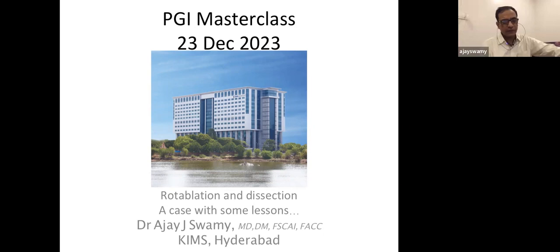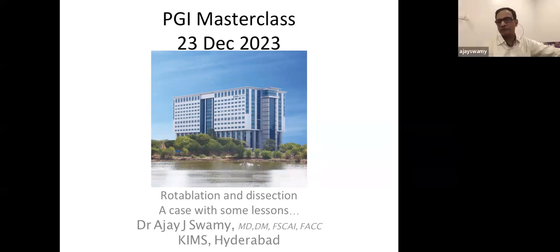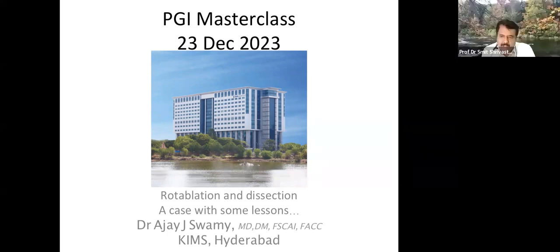I'll tell you one thing. A lot of people are using a single Proglide for 14 French and compressing it. They don't put a second Proglide, and they don't put an Angio-Seal. A single one, yes. They just compress it.